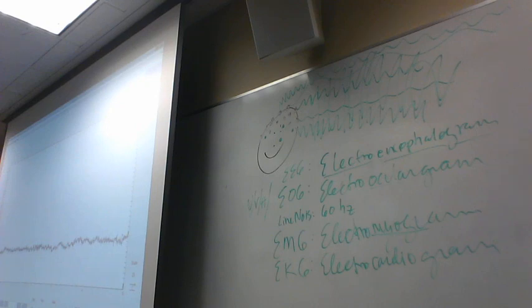A second electrode, called electrode number 2, also has 5 trials. Actually, you know what? Scratch that. This is the same electrode. The black, 5 trials equals when they remembered stuff. Okay, and the green equals times when they forgot.